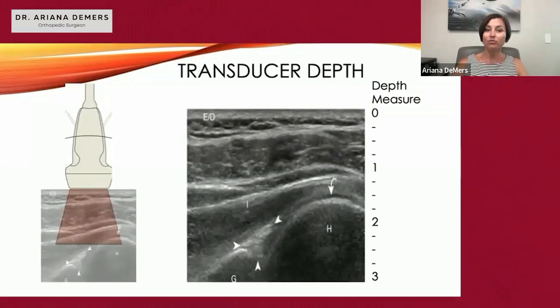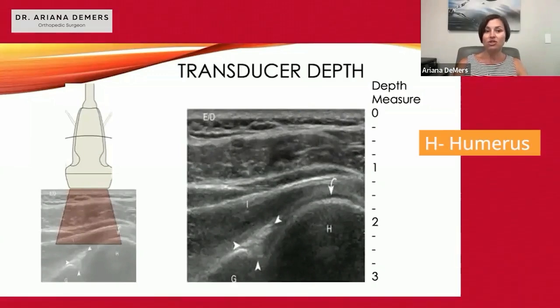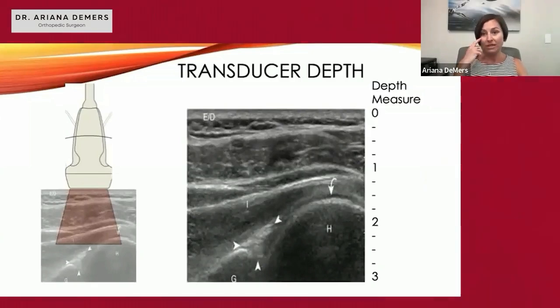You can see the glenohumeral joint, with H being the humerus, G being the glenoid, and the rotator cuff overlying that as well.